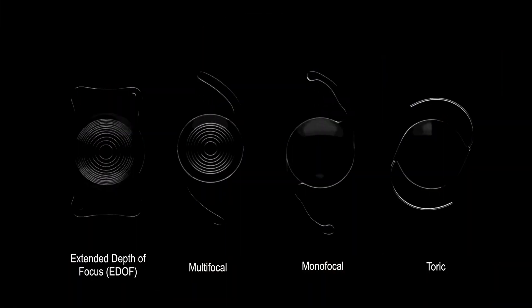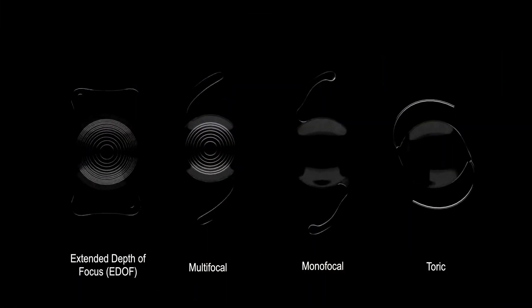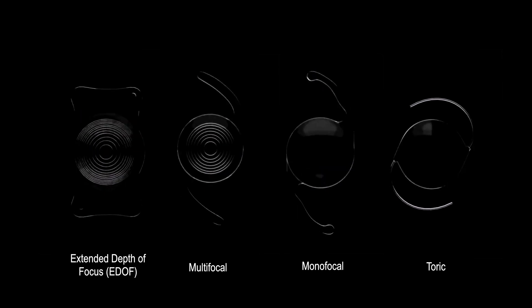There are many different types of artificial lenses that can be used for refractive lens exchange. However, it is mainly the premium lens types like the extended depth of focus or EDOF that are implanted in order to minimize the need for eyeglasses.